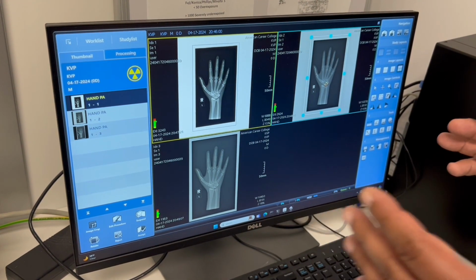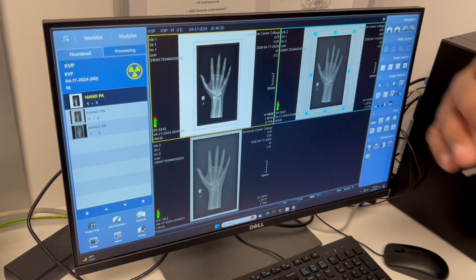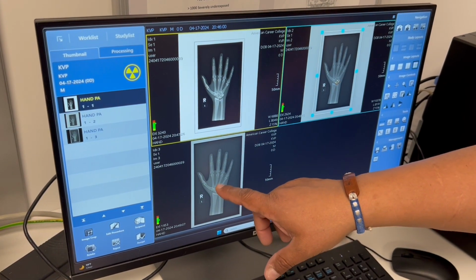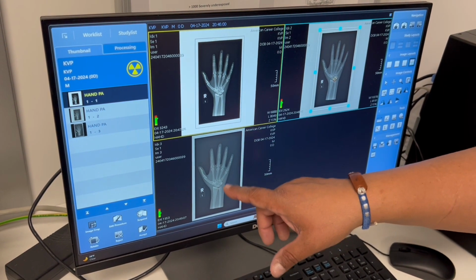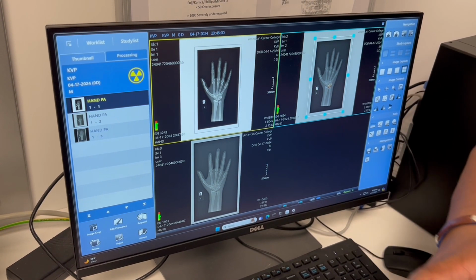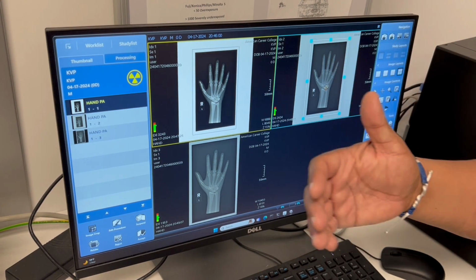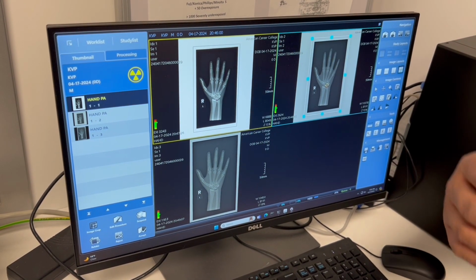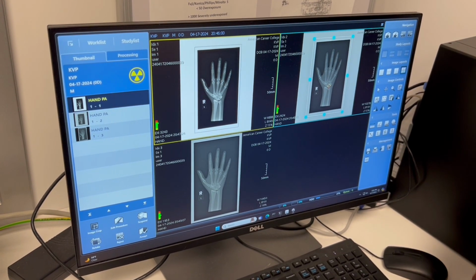So again, when we're talking about contrast, when you go up in kVp, you're going to get a longer scale of contrast. The differences between the adjacent densities and the exposure levels is going to be less. Okay, so that's why contrast lowers. So again, when you have less difference, you're going to have low contrast. When you have bigger difference, you have high contrast. Okay, so again, people get a little confused sometimes, but when you say more contrast, it's more black and white. If you say less contrast, it's more gray.